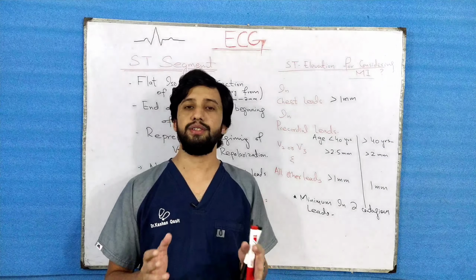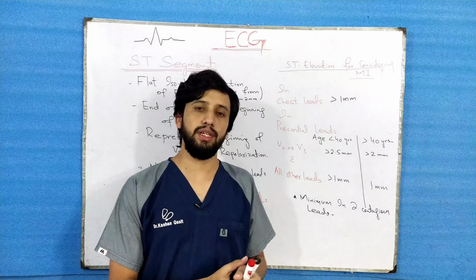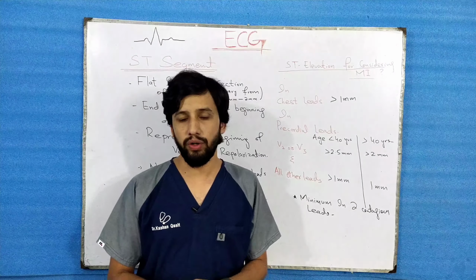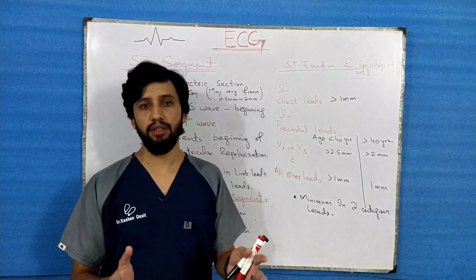Today we were discussing the ECG series, in which we discussed the R wave in the previous lecture. Today we are going to discuss another segment of the ECG complex, which is the ST segment.